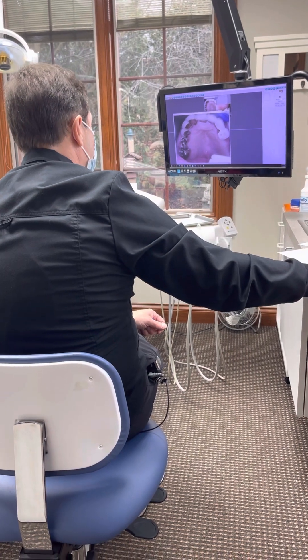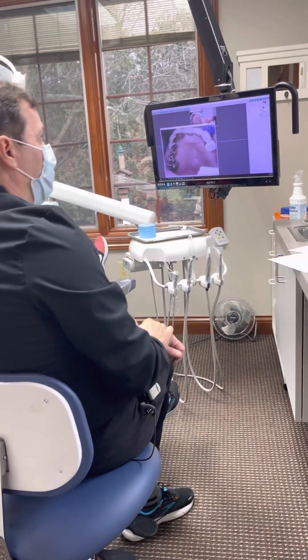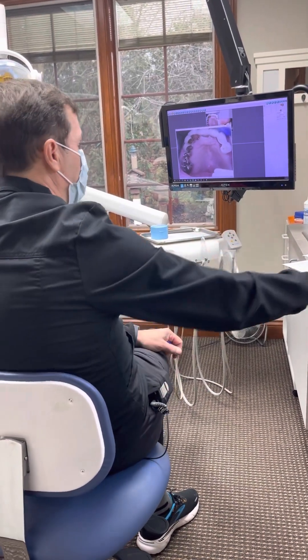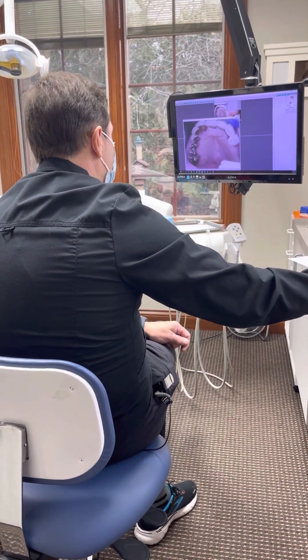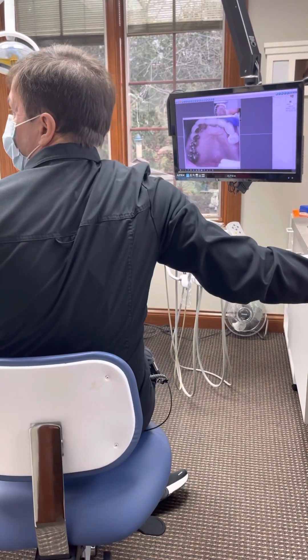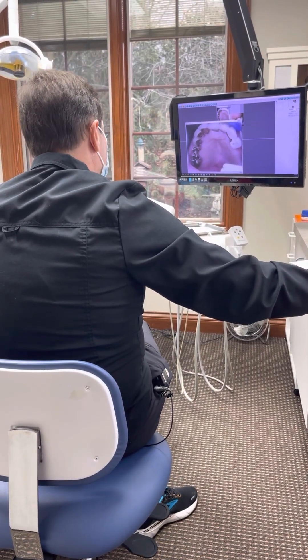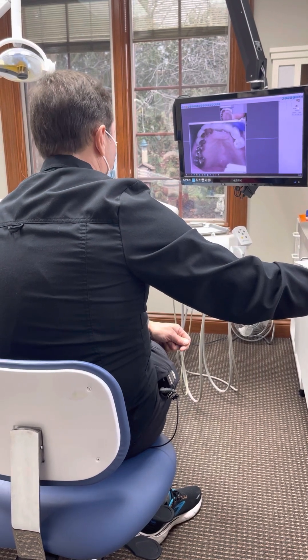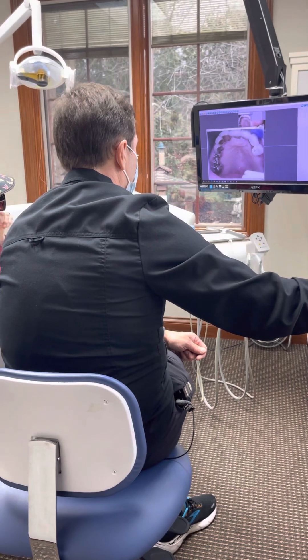This one right here has a cavity as well under it, but I don't know how extensive it is. I just explored it and it's starting to do the same thing that this one did. We'll probably use silver diamine fluoride eventually to try to get her teeth to stop softening, otherwise she's going to lose them all. We've already lost these two.